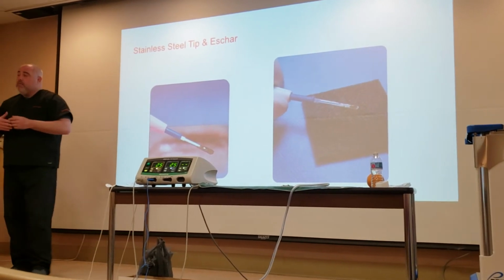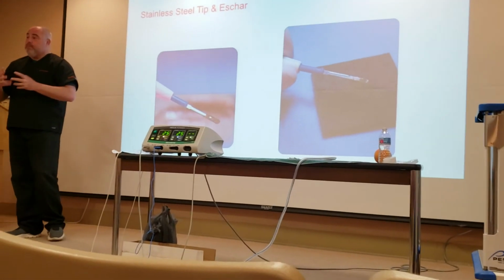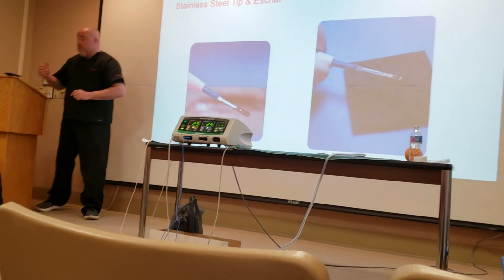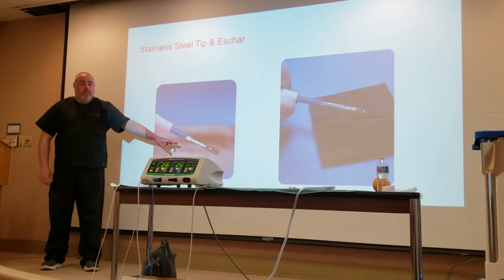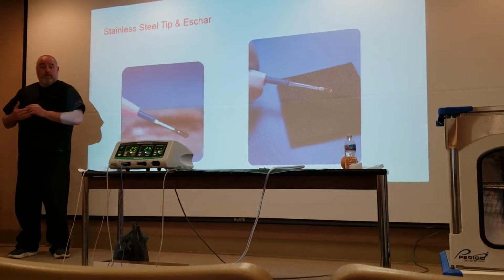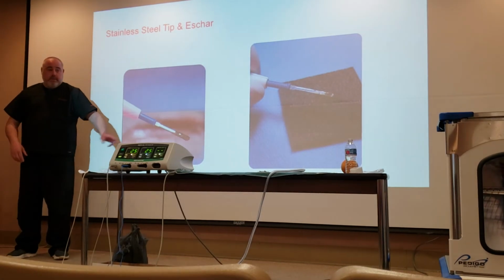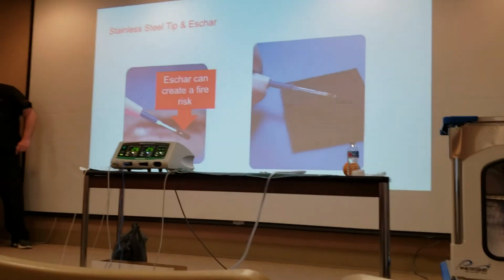So today, there are blades that are coated with Teflon-like substances like PTFE, or even coated with silicone to help minimize sticking like that. This is an electrosurgical safety concern though. The reason you have to clean that is now you have resistive tissue, much like that scar tissue, and where electricity has to take that path of least resistance, it's got to get around that to complete the circuit.